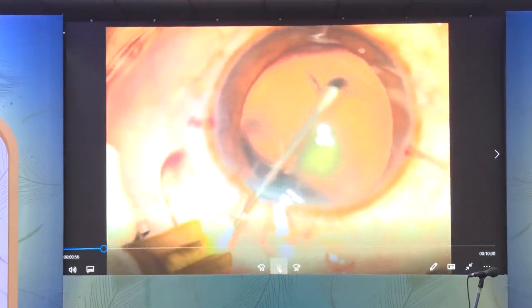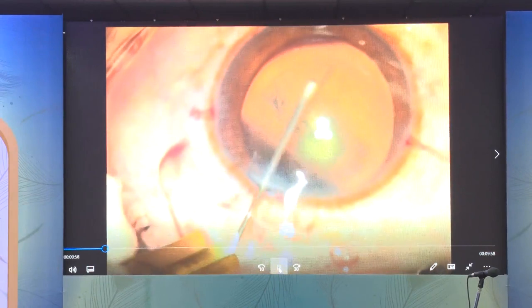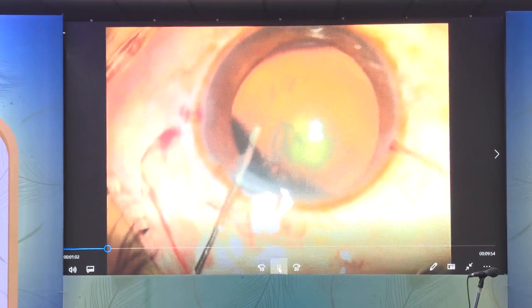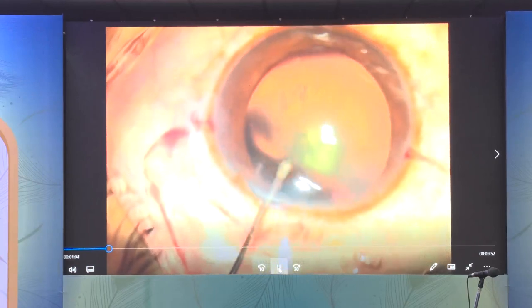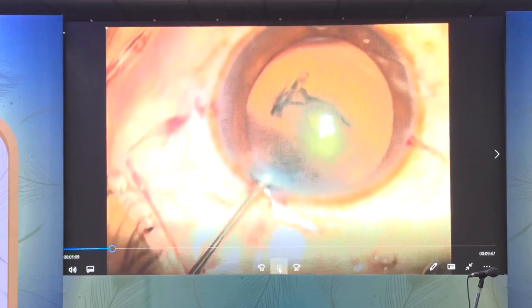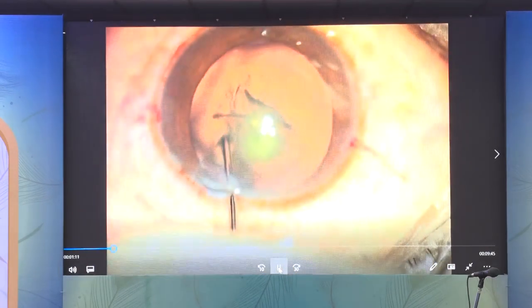Insufflation of the globe should be just enough to flatten the anterior capsule, not overpressurize it. The capsulorexis needs to be well-centered and approximately 5 millimeters — large enough for ease of nuclear emulsification, yet small enough to allow for the placement of a sulcus IOL, should that be required.